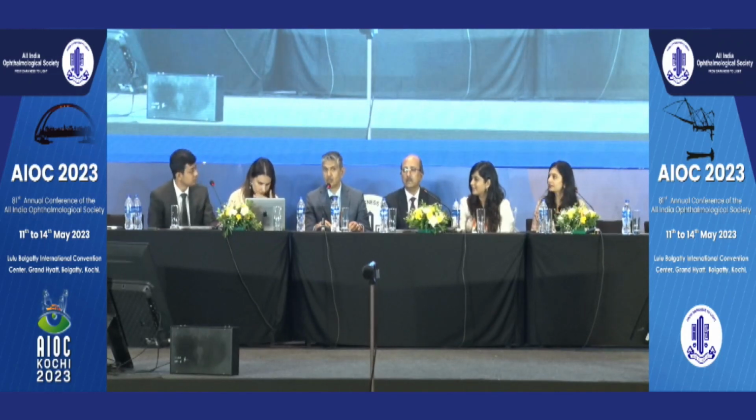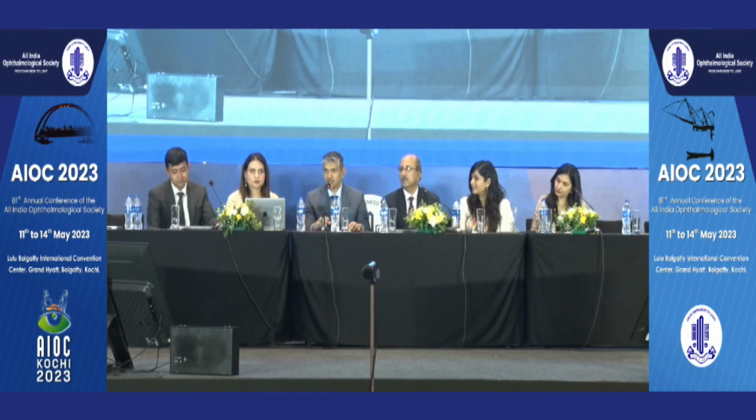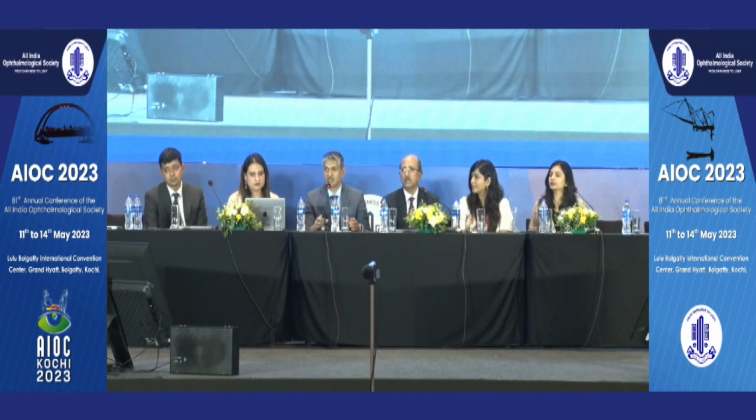There are also dual-optic or exchangeable-optic lenses where you can remove only the central optic, leaving the haptic and the periphery intact, and then exchange it with a different IOL power or multifocality. That's also available. Then Professor Pallikaris also has a ring now. It is a capsular ring made of silicon. So you put the ring in and then place the implant. If it's a toric lens, then rotation is less because of the friction, and explanting the lens is easier because the bag is kept open.